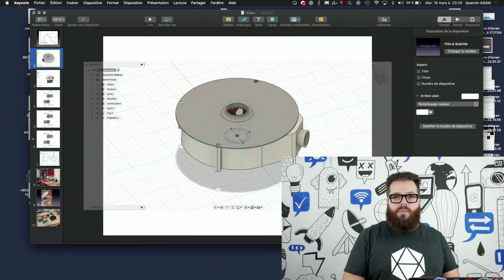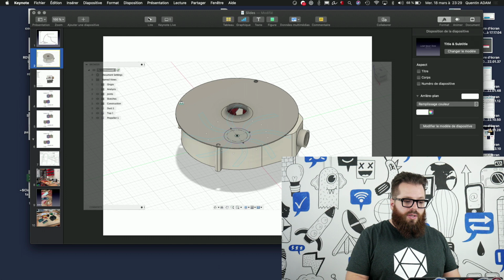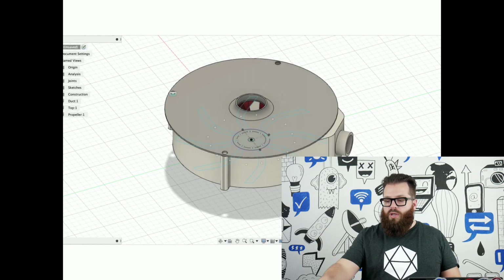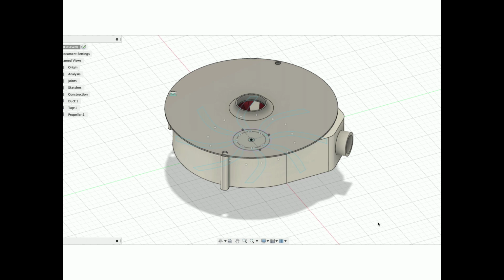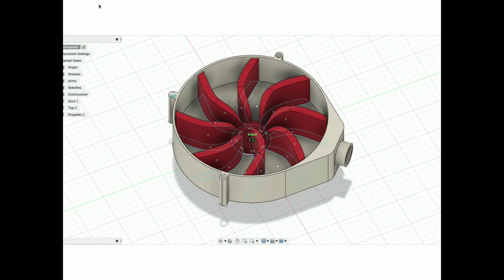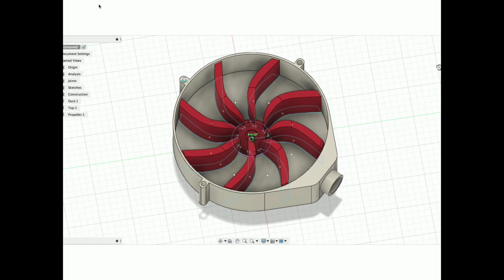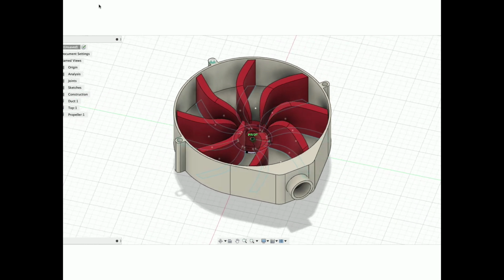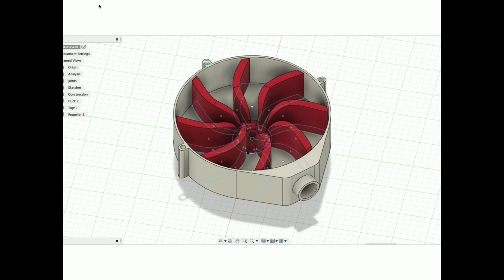So how did we make this? Basically, here is a point. You have a blower. At the beginning, we need a pressure. So this is a blower. It puts air with pressure inside the system, like the turbo in your car, and it pushes pressure to the air. We use a drone engine there to be able to design it.